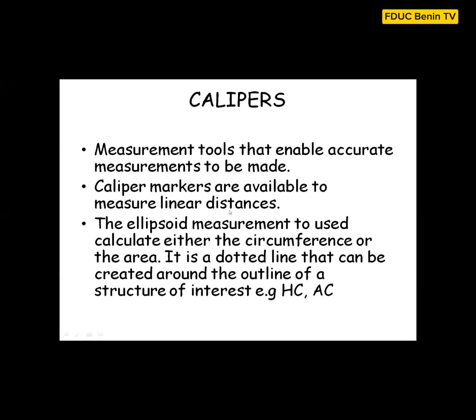So the aim of calipers is to enable us to take measurements. Depending on which measurement you want to take, you click on it, and then you can measure.